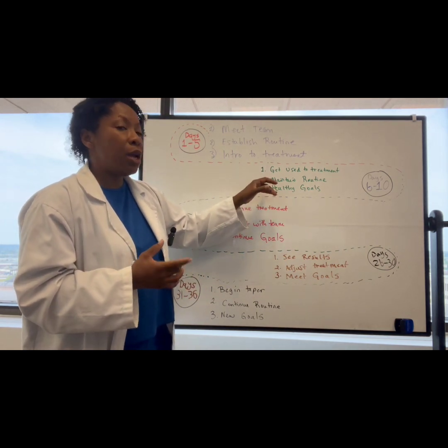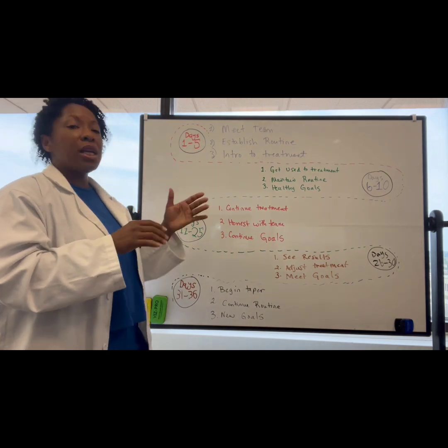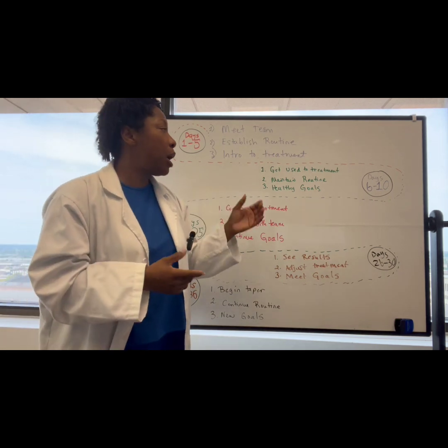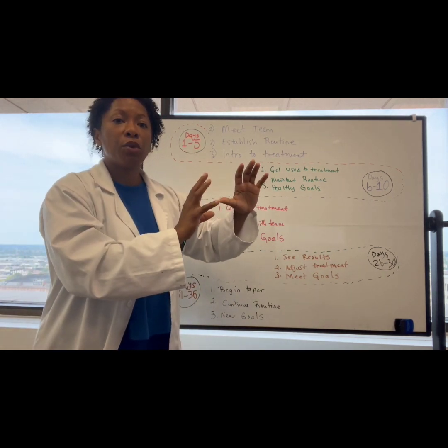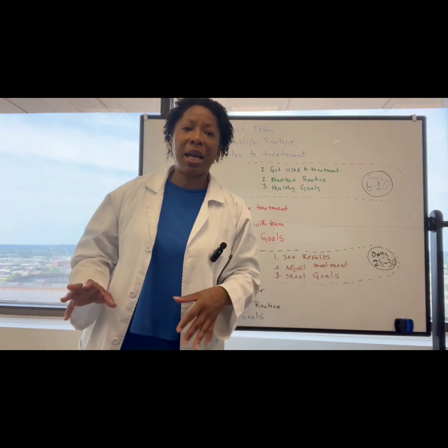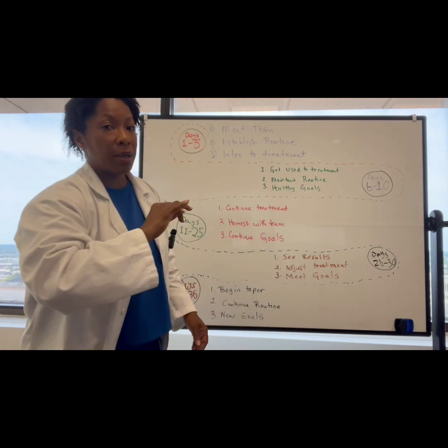Now, you're trying to maintain whatever routine you've already established, and I'm sure that they've already told you certain things, anything from the way that you wear your hair to whether you're having coffee in the morning or eating your morning smoothie or not. You want to try to keep your routines as the same as possible, because the TMS is already changing some things, and everybody knows in a good research story, you don't change too many variables at one time. You stick with one thing, and so you keep your regular routine going.